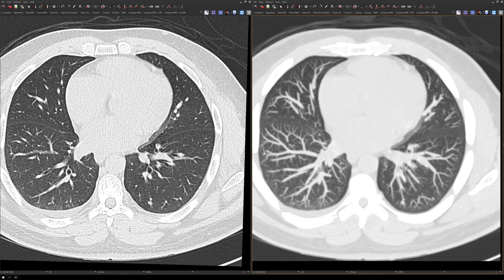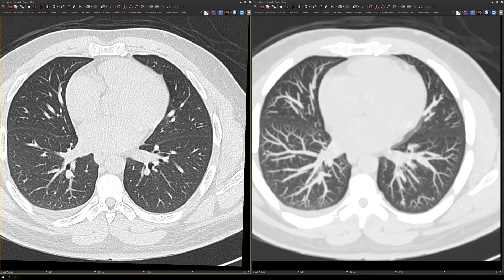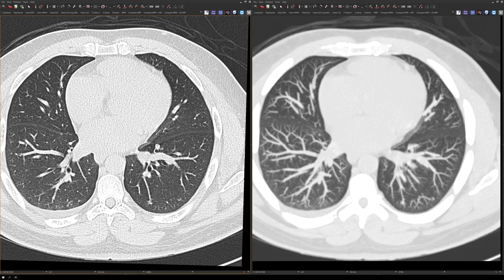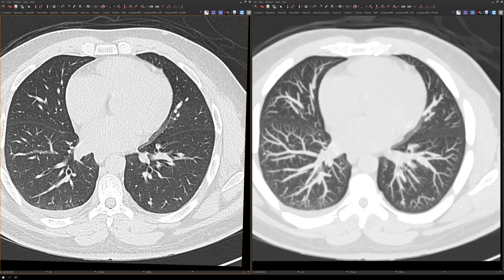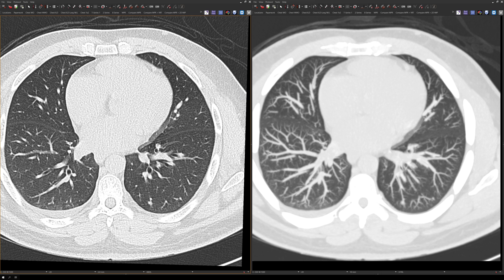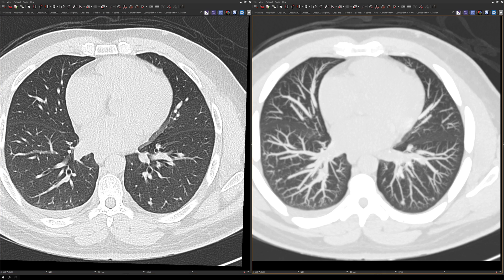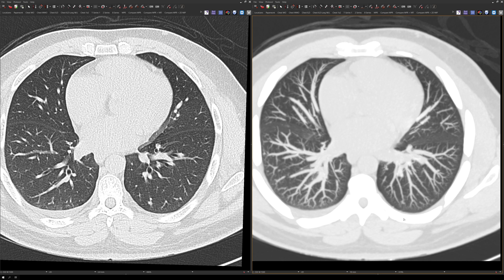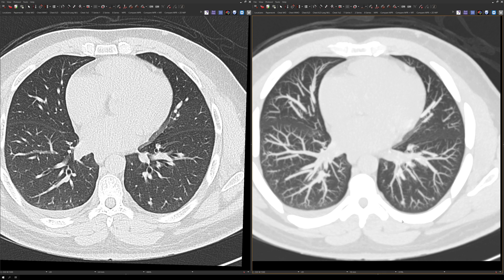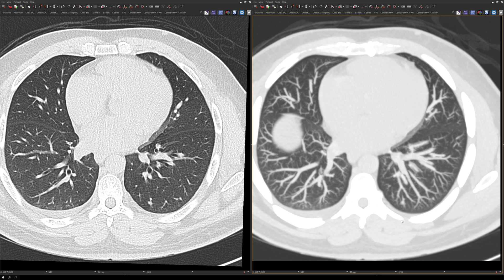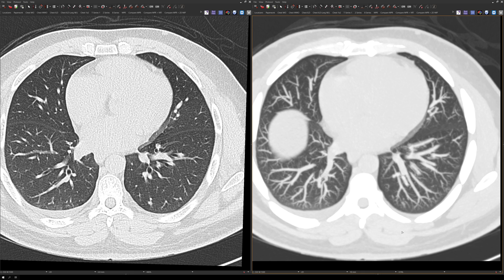The second reason why it's easier to see the nodules on the MIPs is because of the overlap — the nodule showed up on many more slices compared to the regular lung recons. On the regular lung recons, this nodule appeared on only two slices. On the MIPs, scrolling through the same nodule, we see it on six images compared to only two images on the regular lung recons.